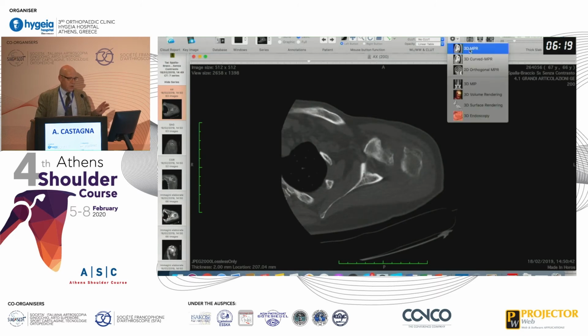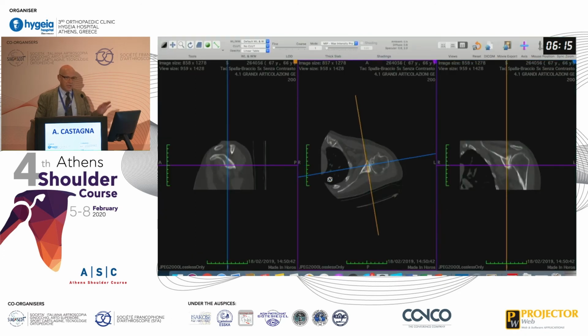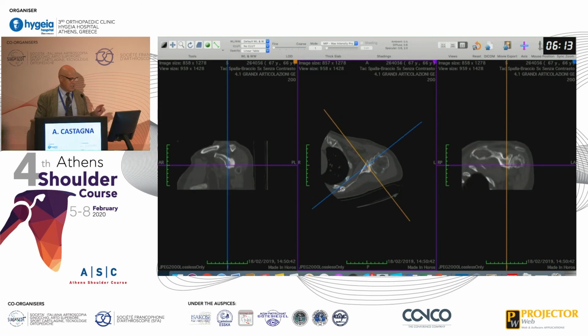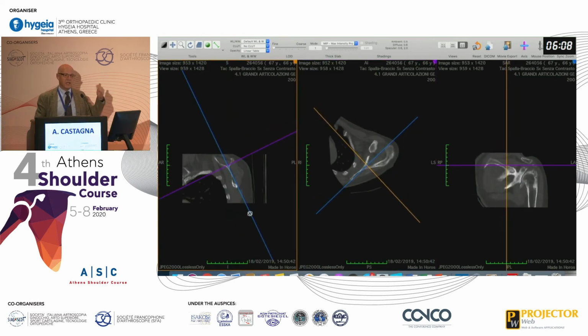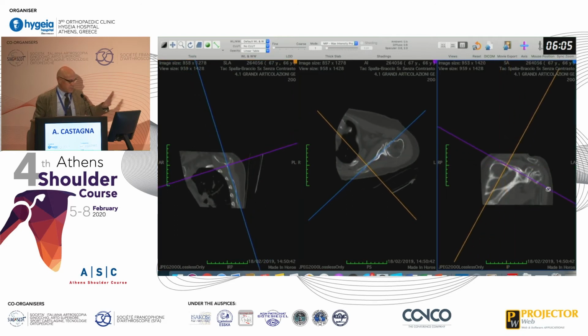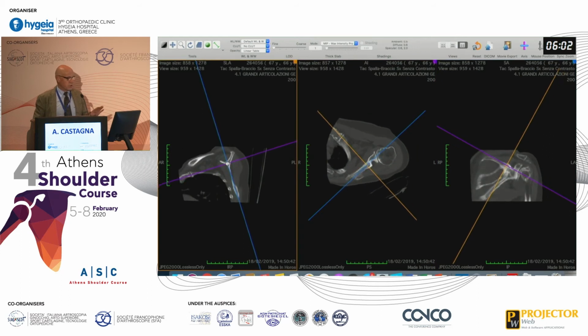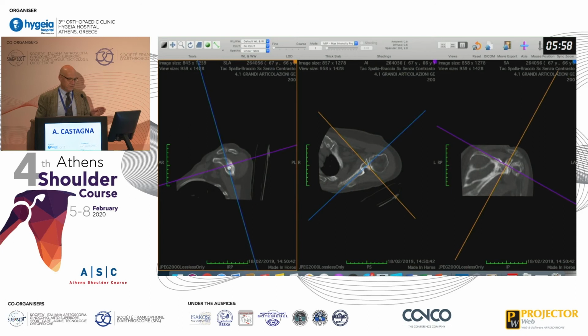So they need to know how to manage the planning. Prepare and tell me, you will see at the end, what is that patient's problem in terms of inclination, retroversion, and erosion of the bone. So they do the job. We train them to this, they do this.